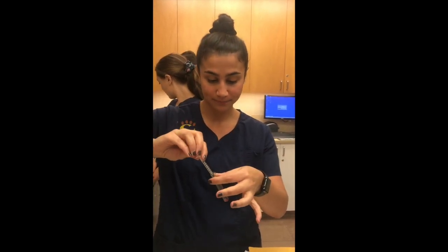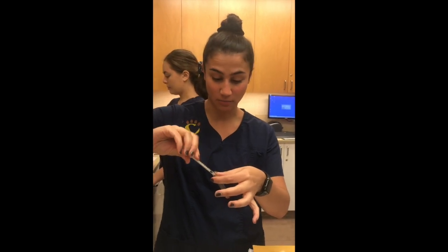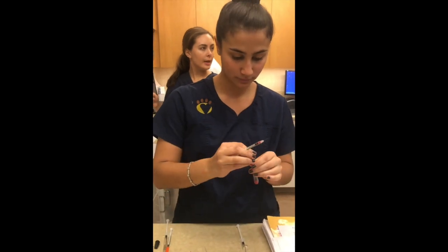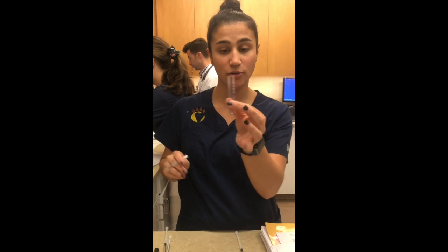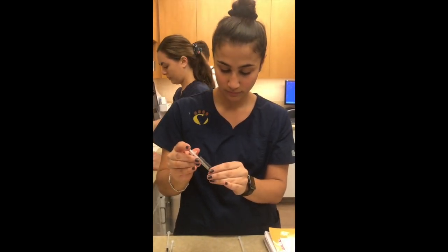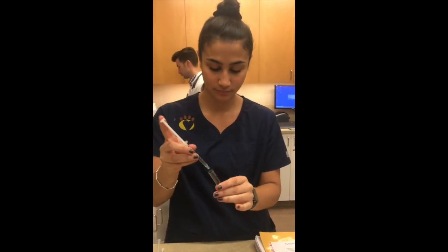So I'm gonna start by taking 0.02 mils of the blood. So I'm using an insulin syringe just because it's smaller and it's much easier to get 0.02. I'm gonna add it to a new tube that I labeled recipient. Great. Now I'm gonna add 0.98 mils of saline.